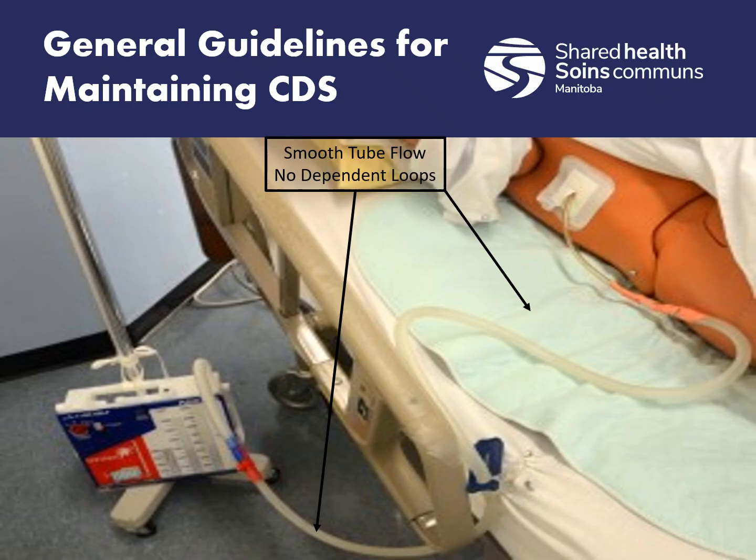We want to get an idea of what we're dealing with so we can know if there's a big change or not. If all of a sudden there's a sudden huge leakage of bright red blood and they've just had pus, that could be not a good sign. That would maybe want us to redirect to a closer facility instead of finishing our transfer. So we want to make sure we're keeping an eye on all this stuff, especially when you're loading these patients into the ambulance. If they're on the stretcher, make sure you watch all your tubing. We don't want any of the tubing getting caught in the mechanisms of the stretcher or underneath the wheel of the stretcher, because obviously that can cause tears, it can cause dislodgement of the tube, and it's just going to prevent drainage appropriately.